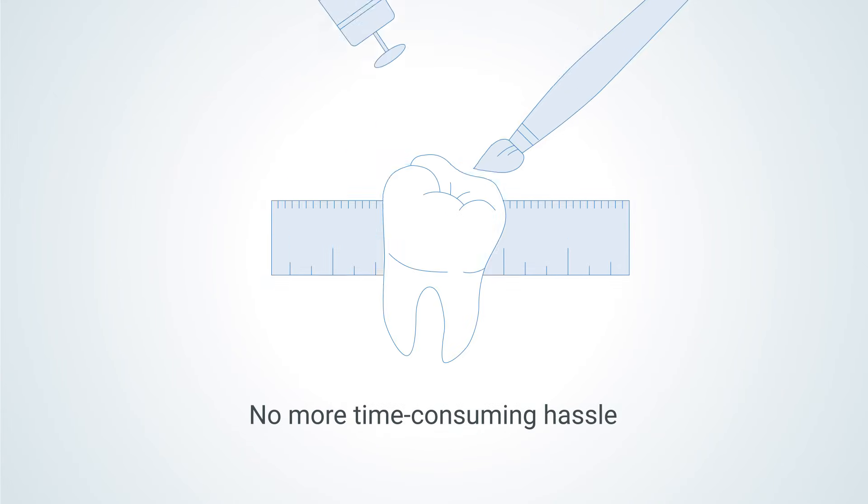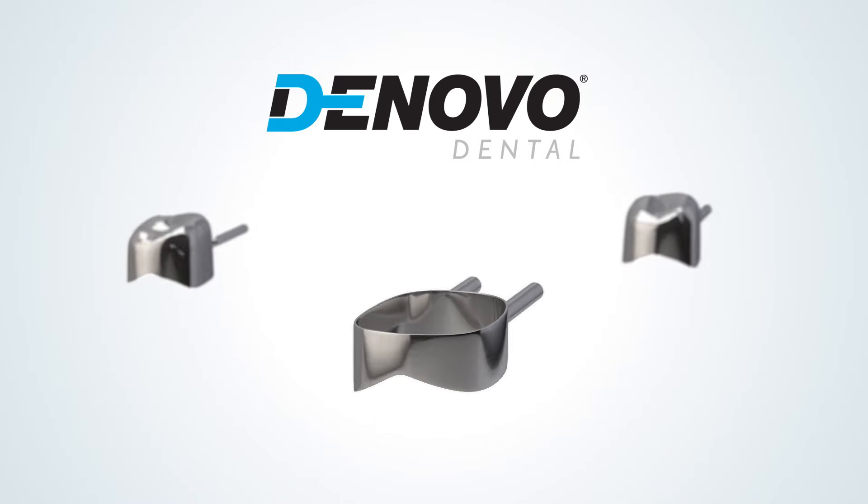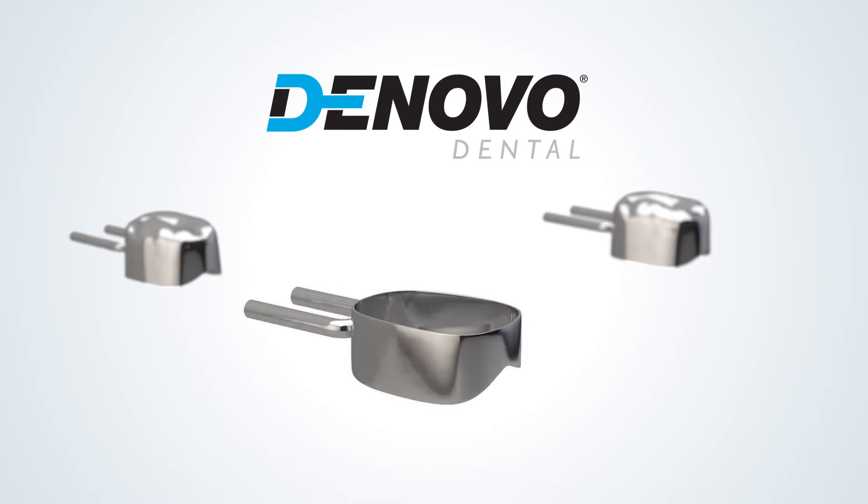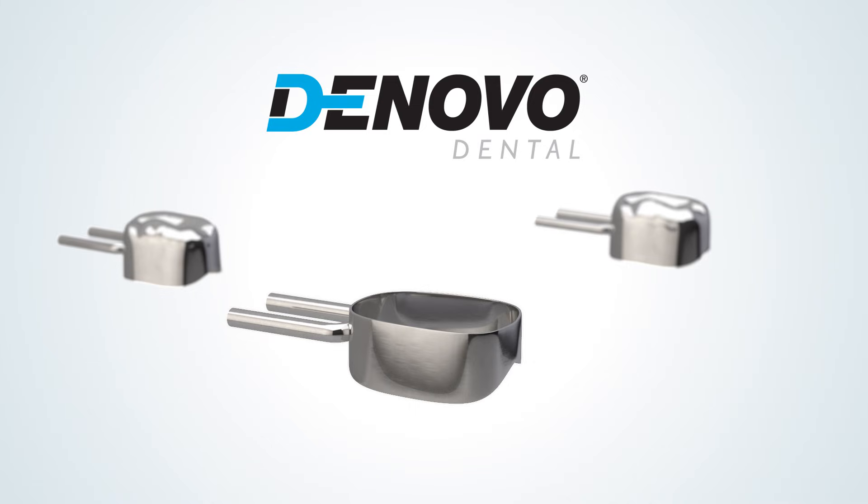With a little practice, this process takes just minutes to complete. No more dealing with the time-consuming hassle of lab devices. With the DeNovo Chairside Space Maintainer System, you can quickly guide the way for erupting permanent teeth, resulting in an efficient workflow, healthy smiles, and happy patients.